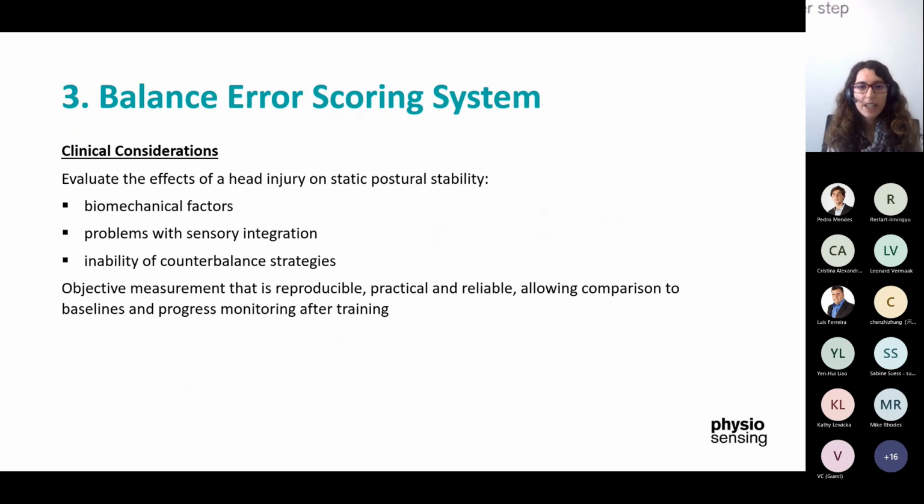So, to sum up, there are several considerations that can be established from this protocol. For example, high values of sway velocity with the feet together condition, the first one, on firm surface should be interpreted with caution, as this condition is the same as the Romberg test, a very well-known protocol, which showed to be insensitive to changes in postural sway after mild injury.